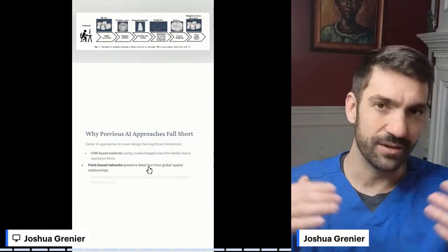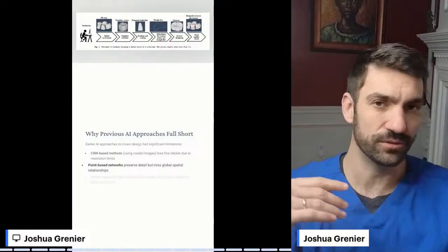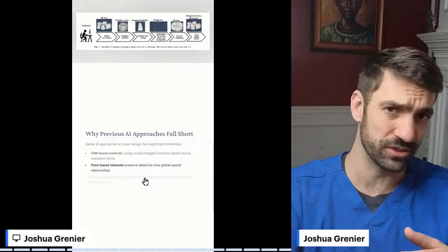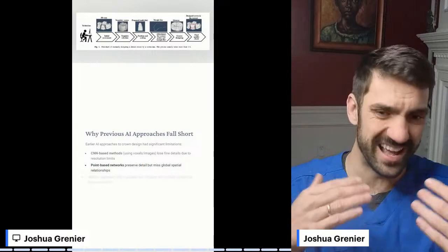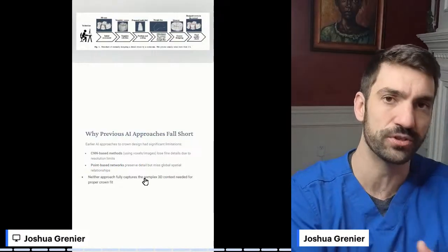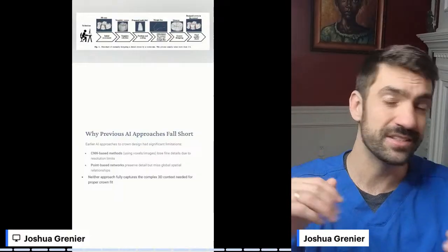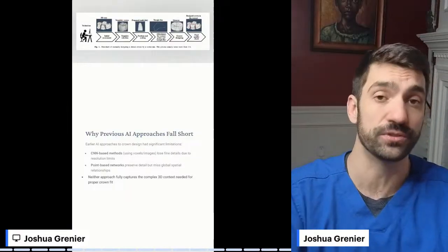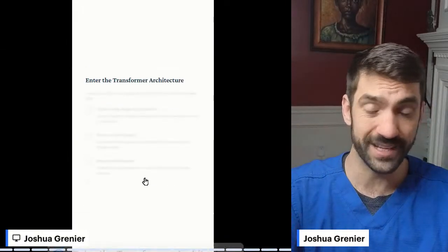There are some point-based networks. There's a lot of systems, but if they don't necessarily have the complexity, it can be difficult to generate the kind of shapes that we look for consistently. A lot of the older ones like Sirona were very effective, but they used almost an algorithmic way of generating this. And a lot of other approaches like 3Shape use a hybrid approach where they're using a subtractive method of the surrounding structures to still generate a shape that is functional, that works. So they're supplementing the generative approaches, which can work very well as well and can be done quite quickly.